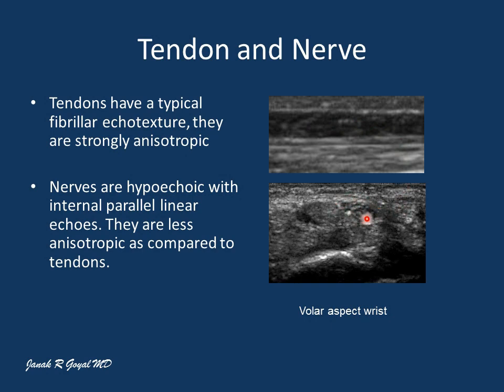Here is the median nerve in the wrist, and here is the tendon shown alongside it for comparison.